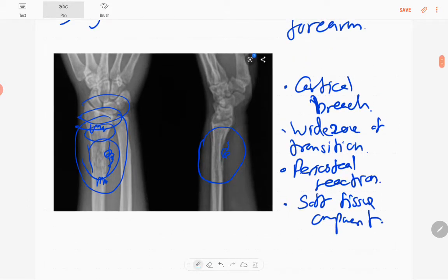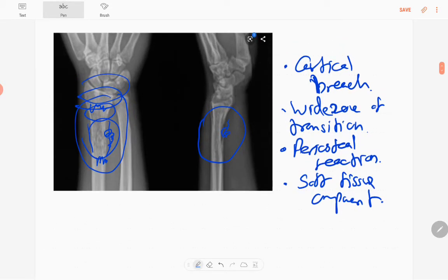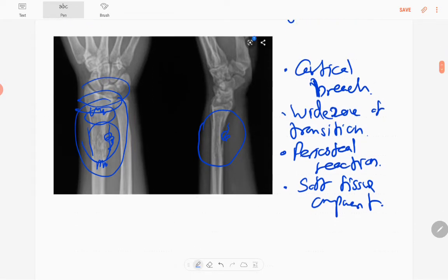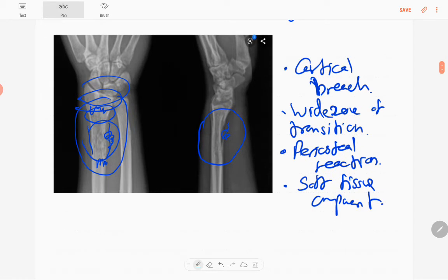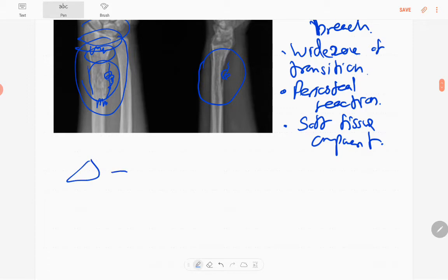All these features contribute to a malignant or aggressive lesion. There are no fractures and no synchronous lesions elsewhere in the bone. The ulna bone is normal. The diagnosis of this lesion is primary bone lymphoma.